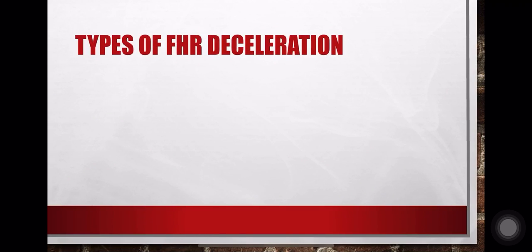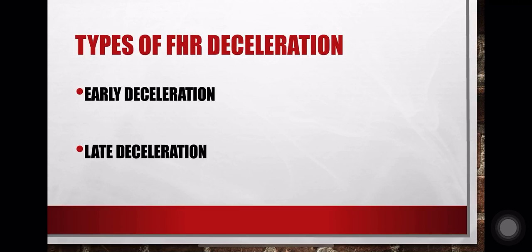Now we'll see about the types of fetal heart rate deceleration. There are three types of fetal heart rate deceleration. They are early deceleration, late deceleration, and variable deceleration.